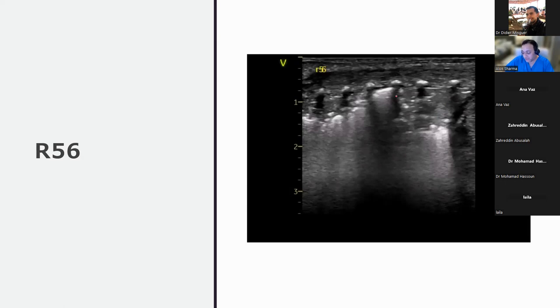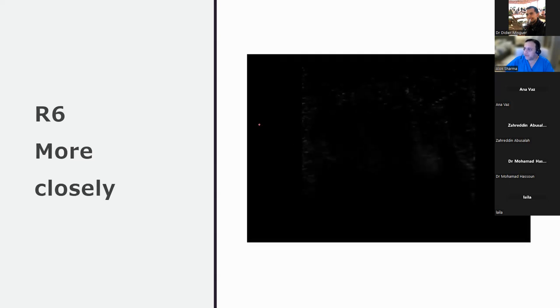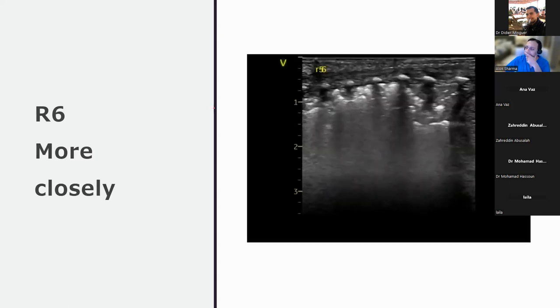Putting Doppler on this particular area showed no blood vessels at all. I haven't been able to download that image because I was looking for it. But actually, when I put Doppler on this particular area, there was nothing that suggests focal blood supply issues or increased hyperemia in these regions, which is why I thought, well, probably atelectasis. And then when you look at it more closely, so this is just another image. And you see how sickle-shaped it looks.